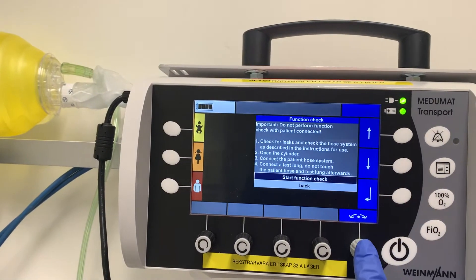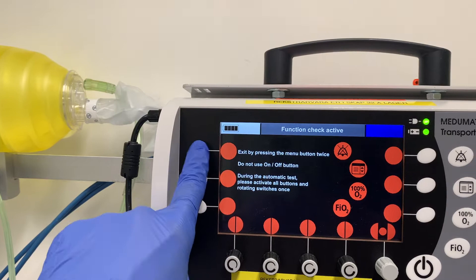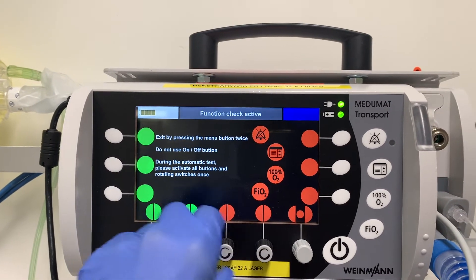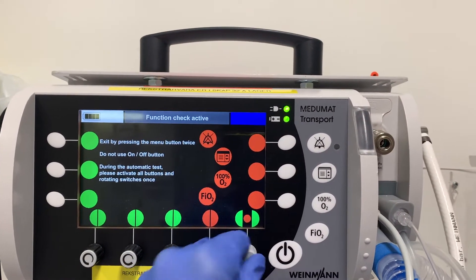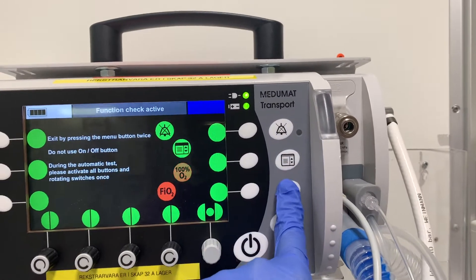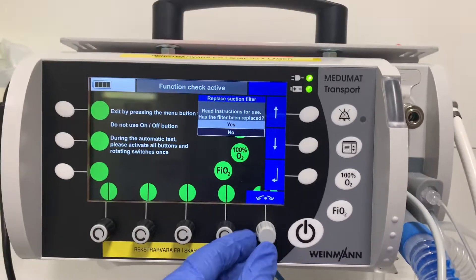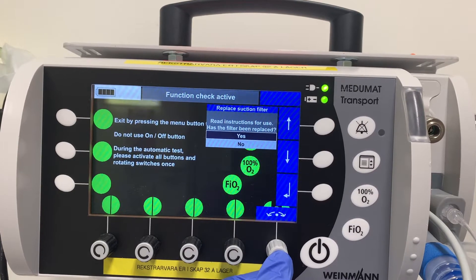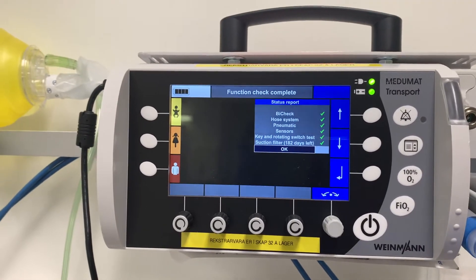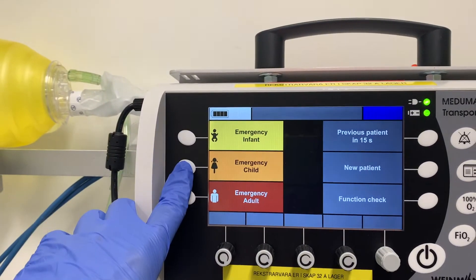It says 'start function check' — just push here to confirm, and push all the buttons so all the red becomes green. It then says to replace the suction filter, so we'll replace that after, and the machine is now okay to go. We press OK.